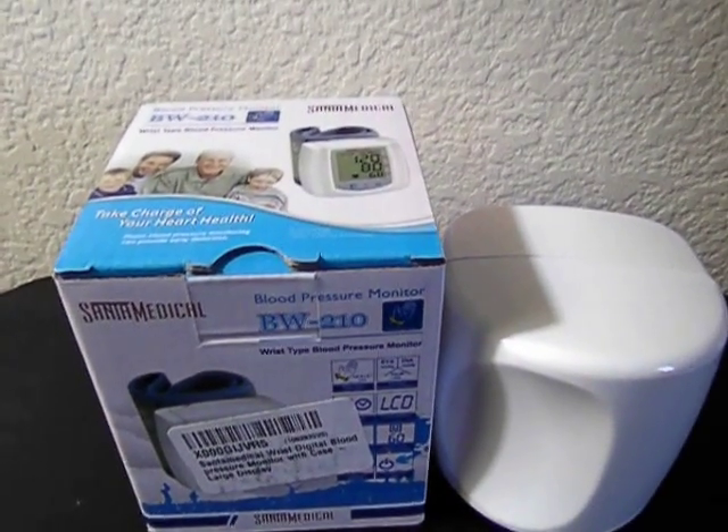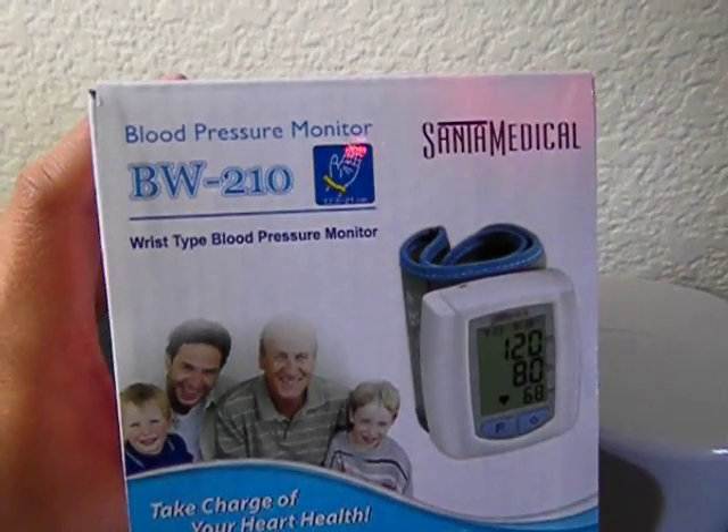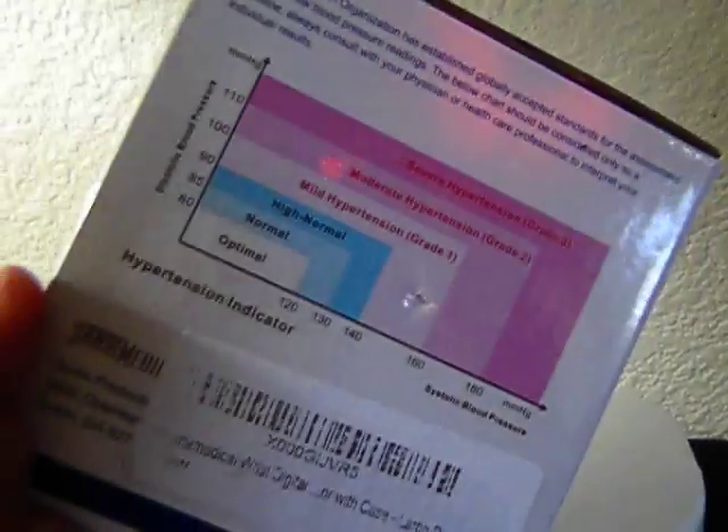Hey guys, I'm here to show you how to use the Santa Medical Blood Pressure Monitor. It's for the wrist, and it has the following specifications.